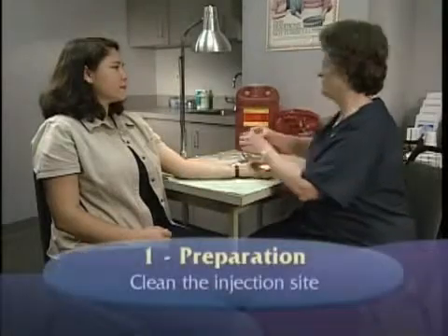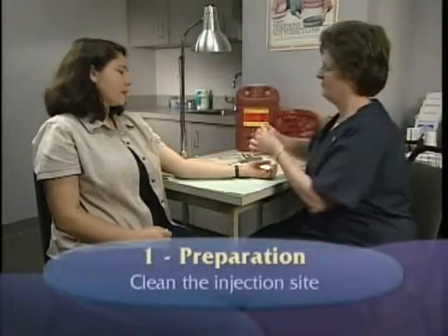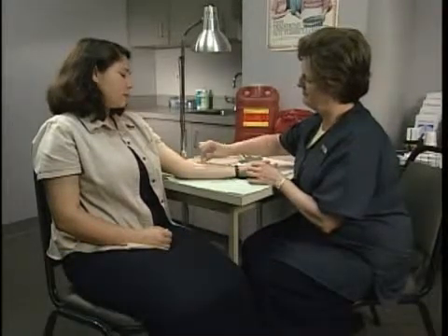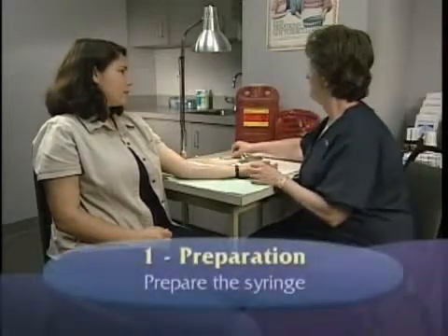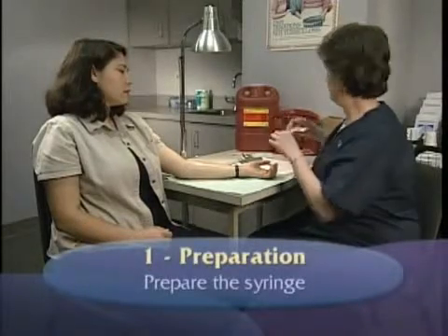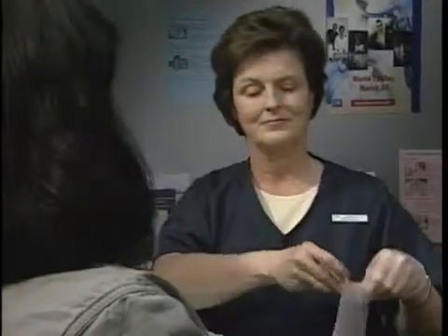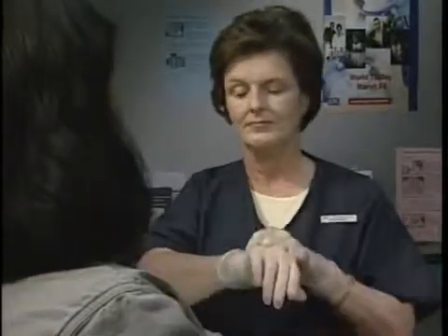After choosing the injection site, clean the area with an alcohol swab by circling from the center of the site outward. Allow the site to dry completely before the injection. Because some of the tuberculin solution can adhere to the inside of the plastic syringe, the skin test should be given as soon as possible after the syringe is filled. Always follow your institution's standard precautions for infection control.